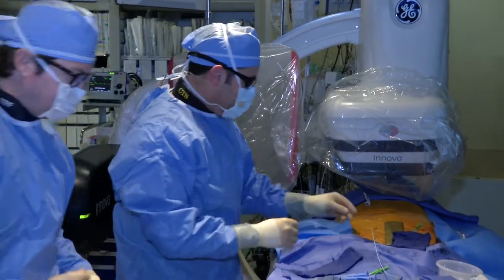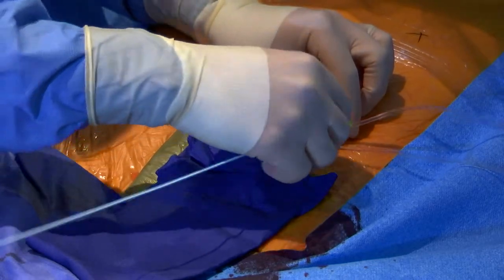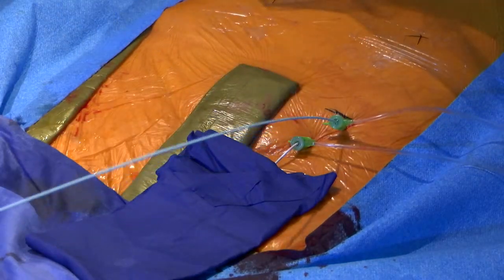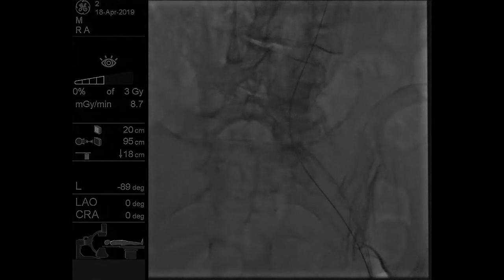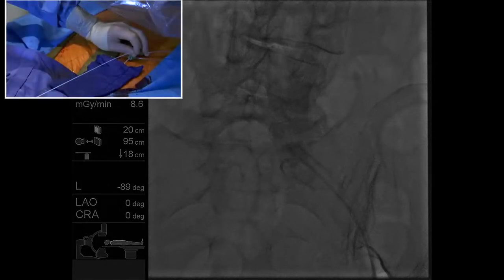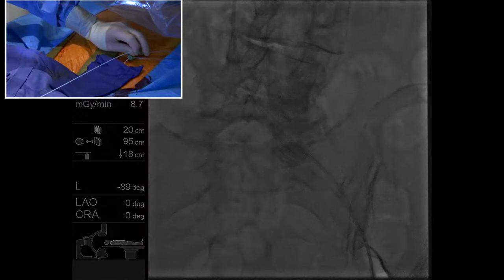So you ready, Ray? Okay, so we're just going to insert the rim catheter here from the left side. Go ahead with your wire. Hopefully you guys have fluoro. Can you guys see the fluoro image? Jen, I don't know if you can see the fluoro image. Yes, okay, great. So we're just coming up from this side with a catheter. Pull back on the wire. That's the rim catheter. I'm going to rotate it around to hook the other side. Go a little higher up there. There we go. Rotate it. See if we can get the other side to hook.